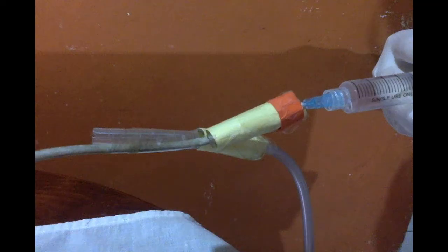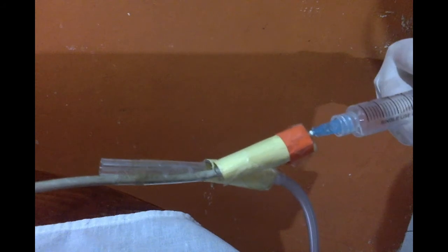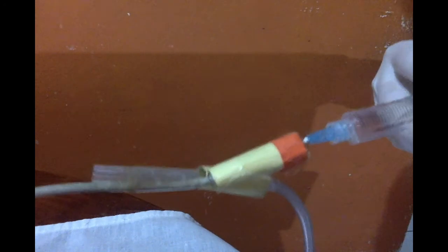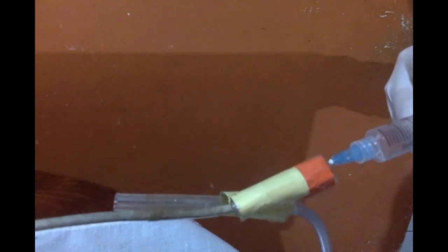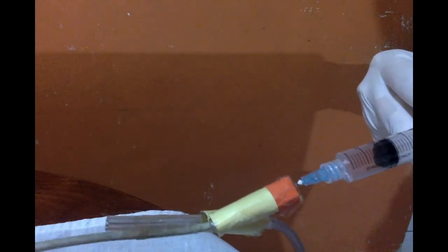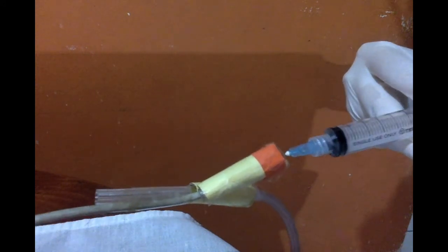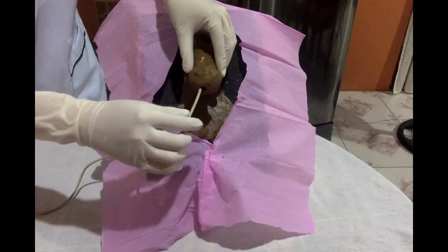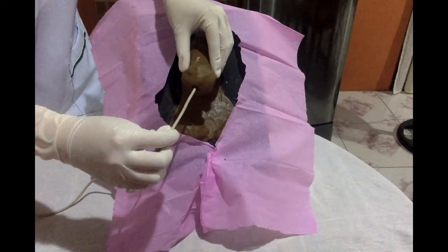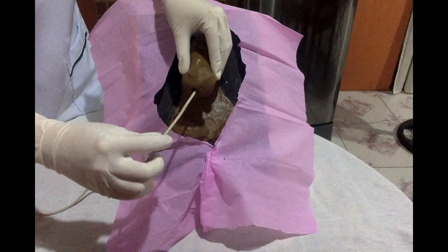Since the balloon port is rubberized, we will be needing the needle of the syringe. Then I will inflate the balloon with this attached pre-filled syringe with 10 ml of water. So this is done to secure the catheter placement. Then I will gently pull back the catheter until it stops. So again, this is done to secure the catheter placement.